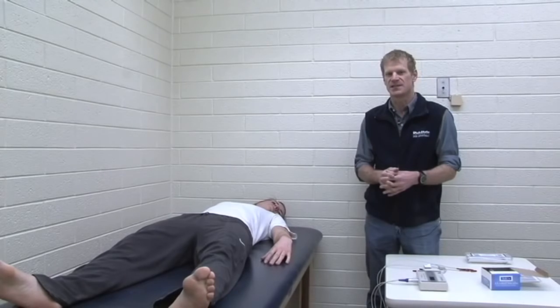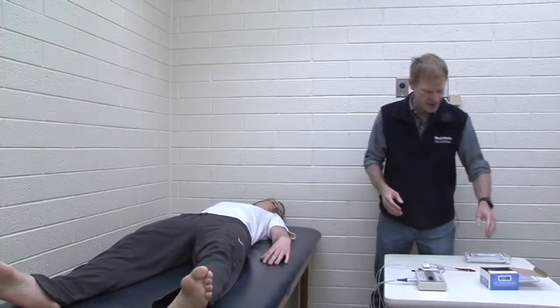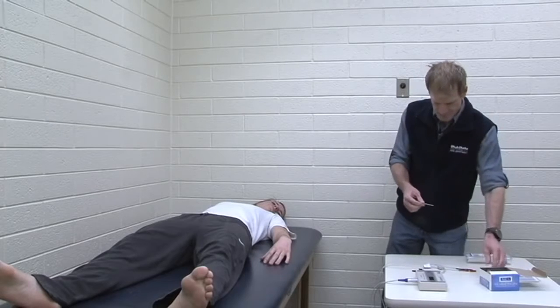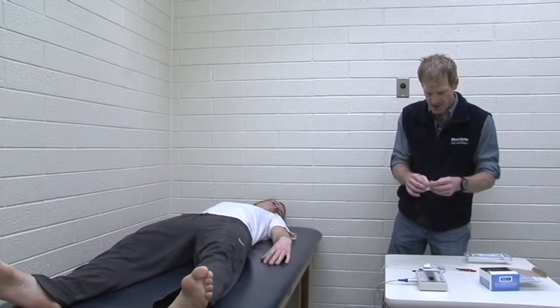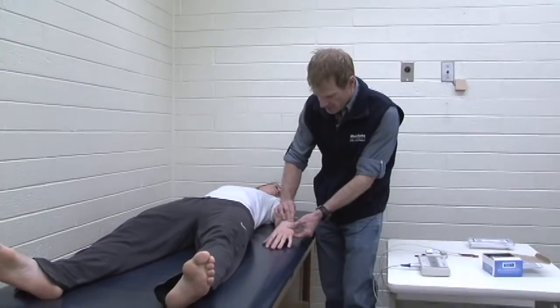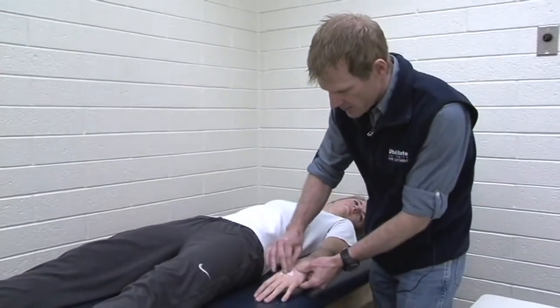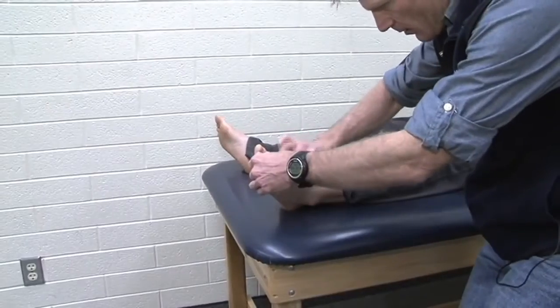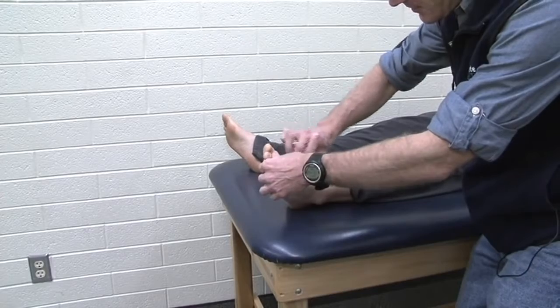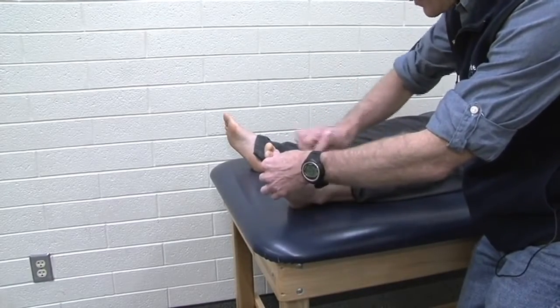We're measuring the impedance or the resistance to the electrical current going through the person's body. The first thing we're going to do is clean up some areas on our subject's skin so that we have good conduction, and we're going to be placing four electrodes — two electrodes on the wrist and hand, and two electrodes on the ankle and foot. We're going to be using the same side of the body for those electrodes. Traditionally, we measure things on the right side.